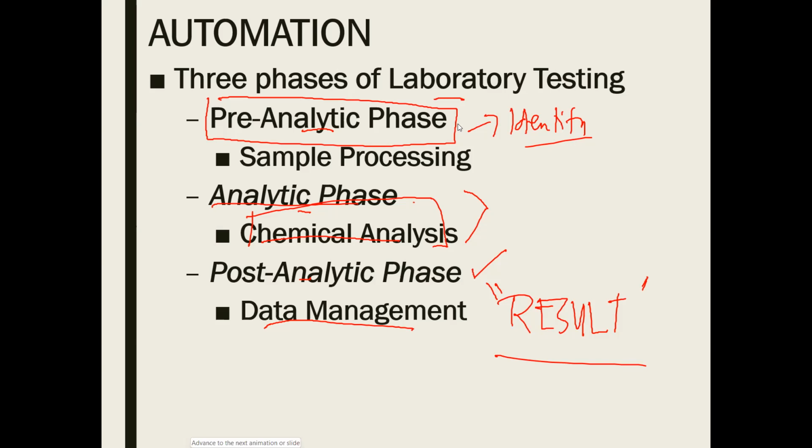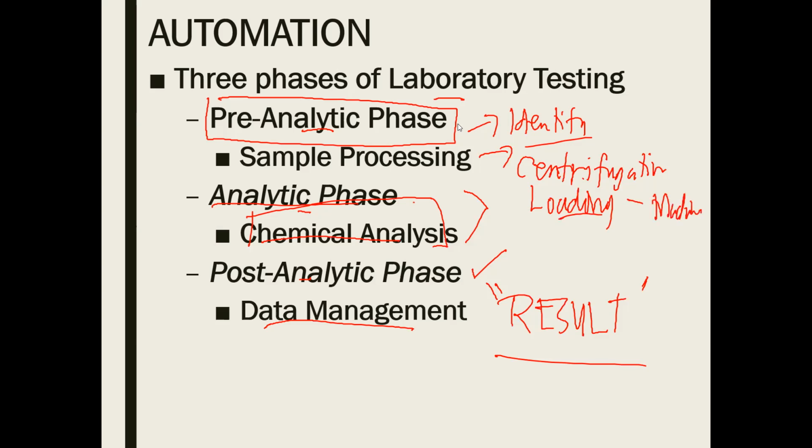So again, the pre-analytical phase includes your sample processing, your centrifugation, and your loading. When we say loading, it is loading in the machine or loading in the equipment.